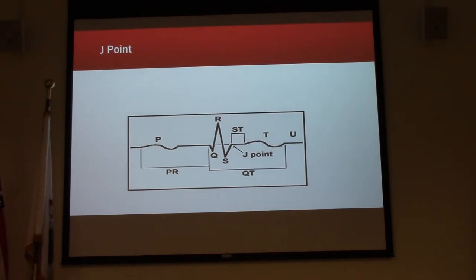You guys have been taught mainly one thing with 12 leads. Recognize the ST segment elevation, because that's what you can do something with. You can give them aspirin, nitro, morphine, get them to a cath lab, and you've saved the day.